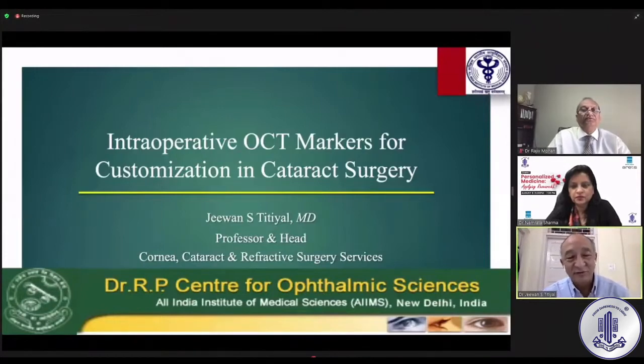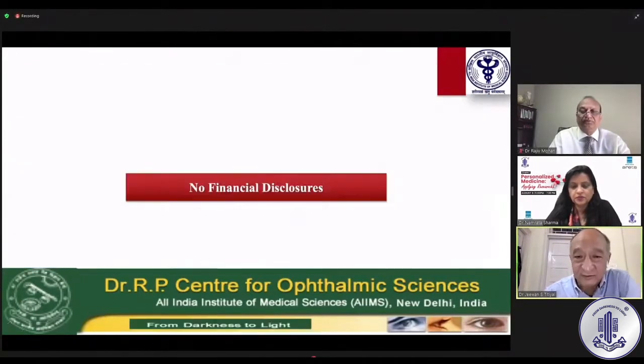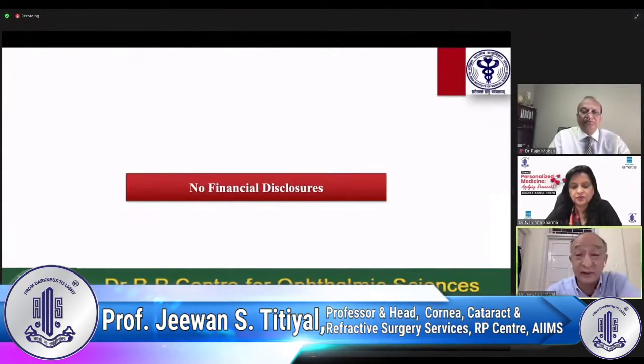I think this was a wonderful session which we had, and my talk is a little on a different side. But being a clinician does have a significant role in customization of any procedure. That holds true for cataract surgery also. And intraoperative OCT has given us a new thought, new thinking, new vision, a new way to look into cataract surgery for our patients, and for research, patient care and teaching also.